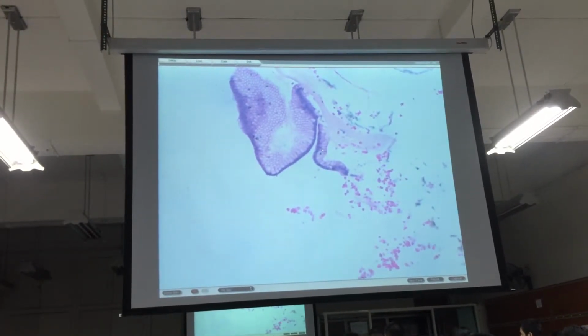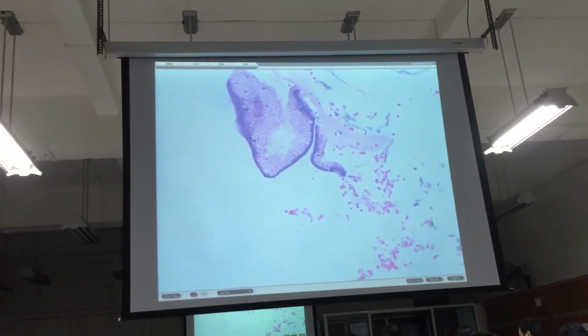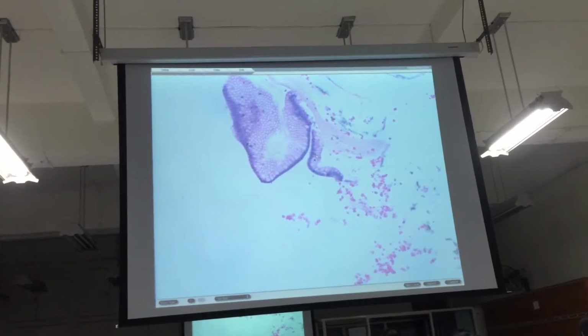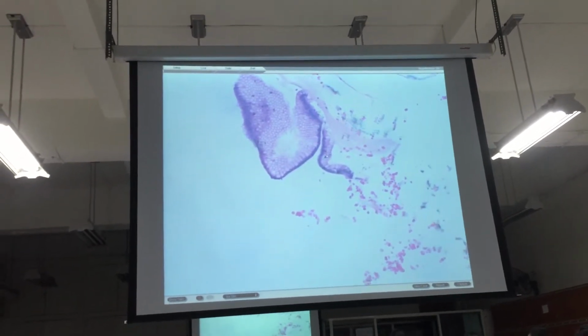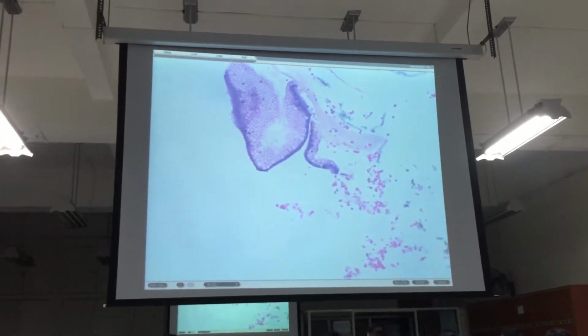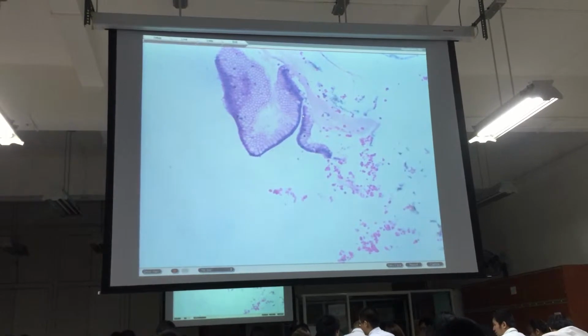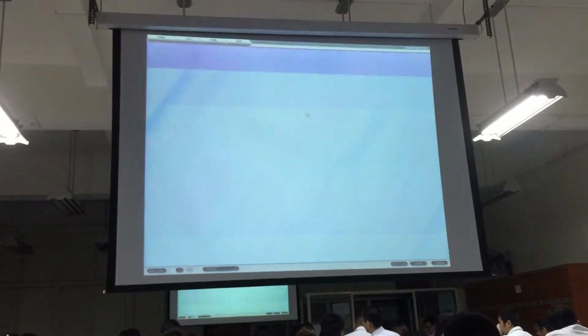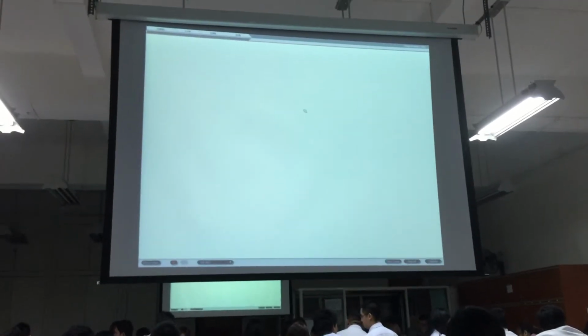But if you see necrosis, stromal invasion, you call this now mucinous cyst adenocarcinoma. Okay, but this one, the lining epithelium is just a simple columnar epithelium. There's no stratification. This is benign. You call this either mucinous cyst or mucinous cyst adenoma.